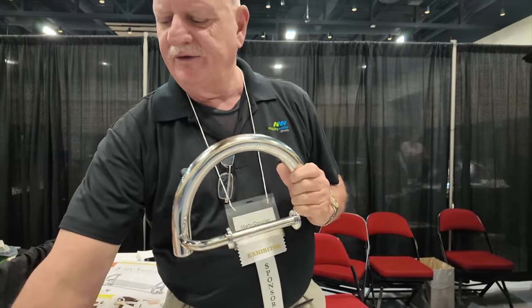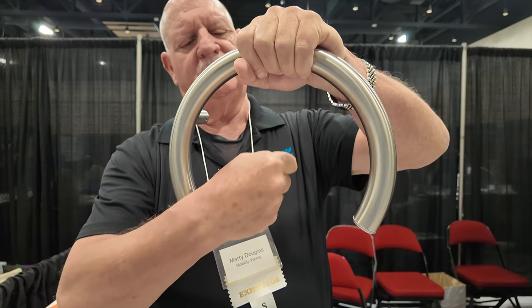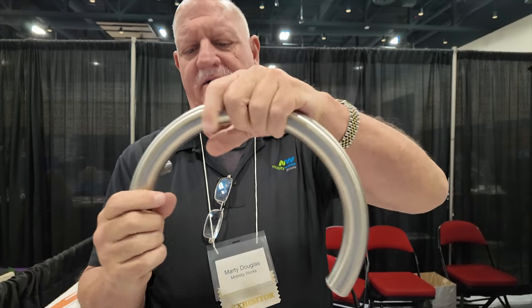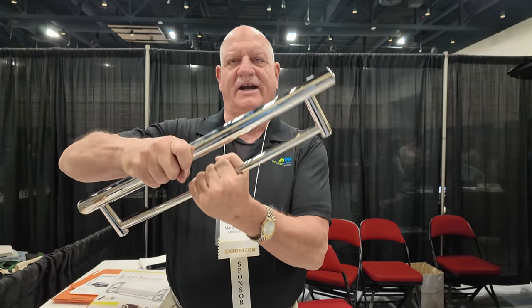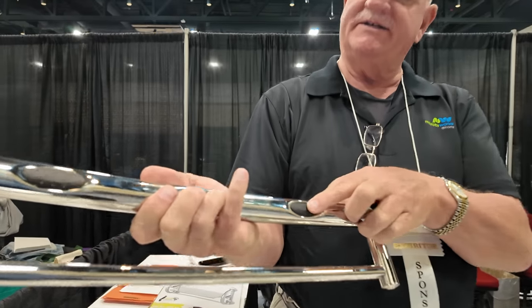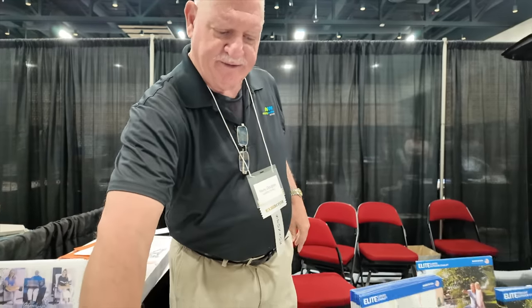That's nice. This one right here goes over the shower water controls. Got you. So grab onto it. Yeah, when they're turning the shower here, they're hanging on to here. That's just your modern day grab bars. You got your towel rack bar now. Instead of hanging on to the towel rack, you got your grab bars. And they got grips on the inside and they go into the studs so they will not come out of the wall. Good stuff. That's nice.